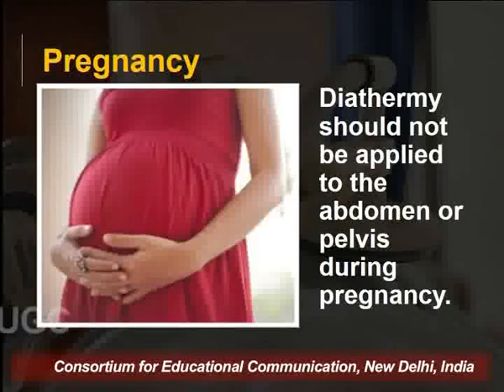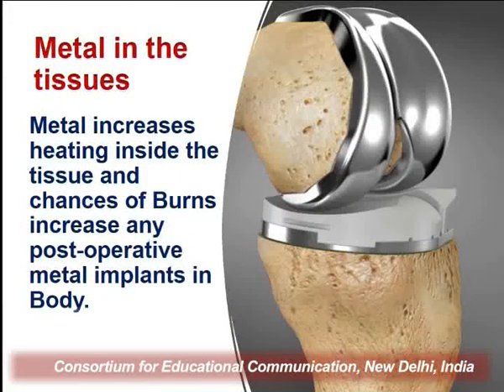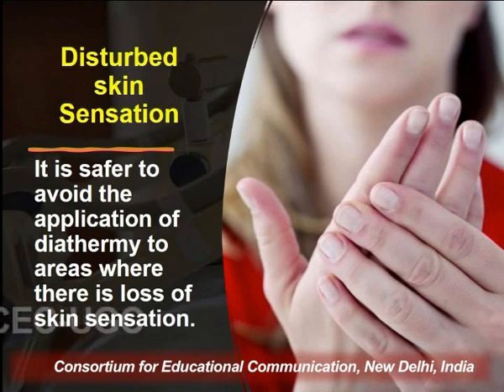Then pregnancy. Diathermy should not be applied to the abdomen or pelvis during pregnancy. Then metal in the tissues. Metal increases heating inside the tissue and the chances of burn increase, as with post-operative metal implants in the body.